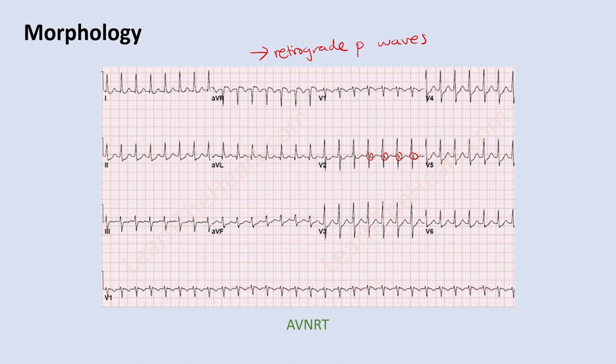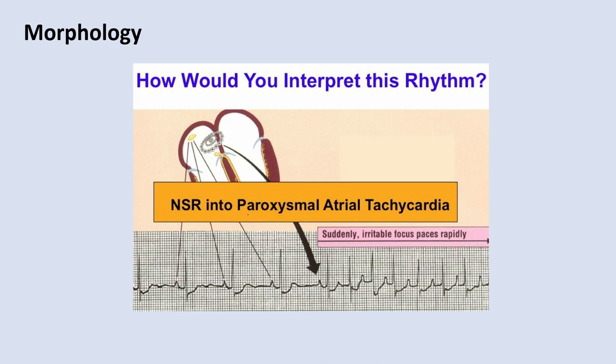This is paroxysmal atrial tachycardia, or PAT. You have a normal P wave morphology, and then all of a sudden tachycardia starts with a different P wave morphology. An ectopic focus — rather than the normal SA node — suddenly drives the heart, causing tachycardia with a new P wave morphology and a rapid rate.